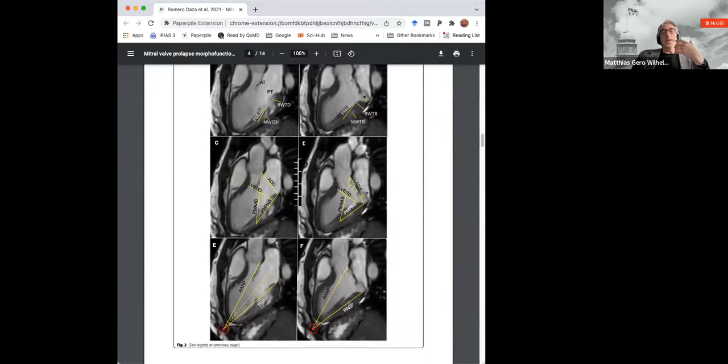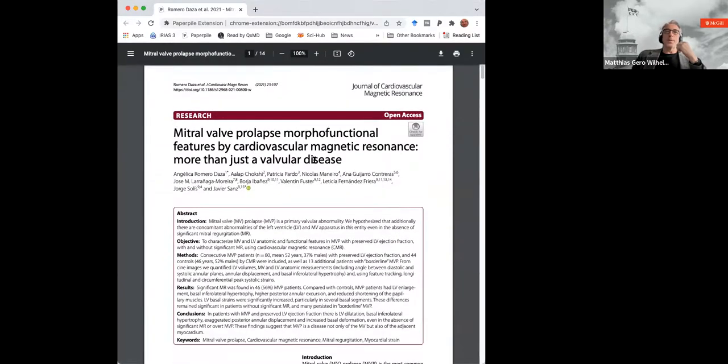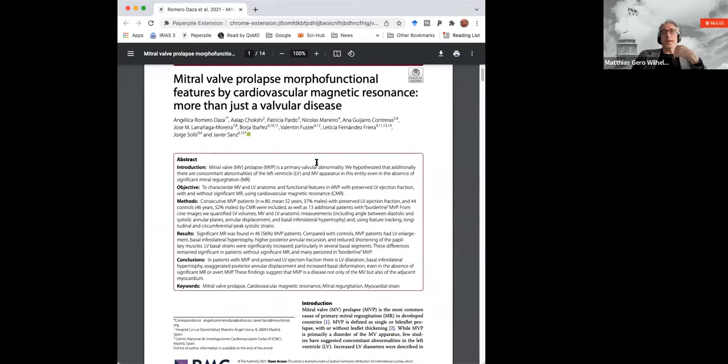Mitral valve interventions are also getting more and more used, and there may be some role for transcatheter or arterial implantations of valves in the cath lab. So MR is better set up than any other imaging modality to identify such markers, and I think this paper did a great job in outlining some of that, and hopefully it triggers more research on the prognostic value of these findings. And I'm sure this group does that, but I also hope that others will join in.